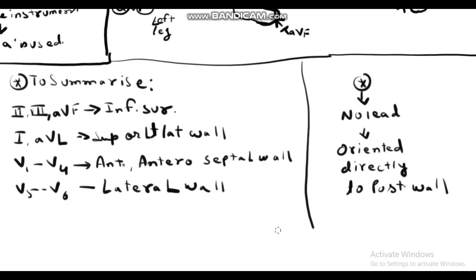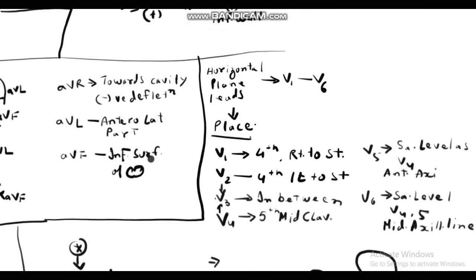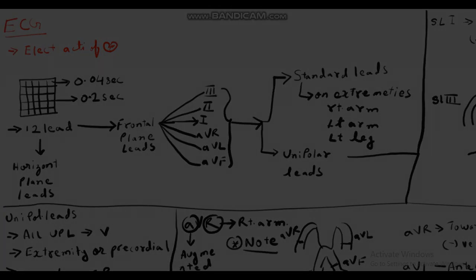So guys, I hope I have cleared the basic principles of the leads, so you can understand how leads are placed and how these are oriented towards the heart.